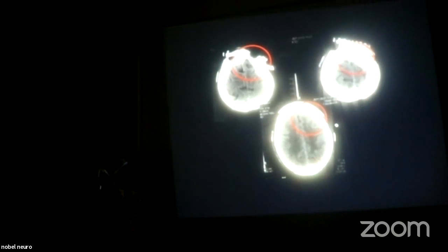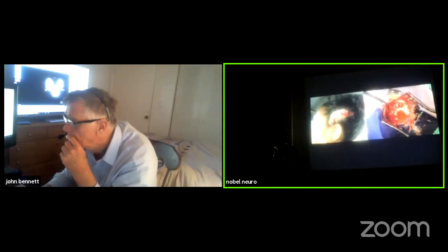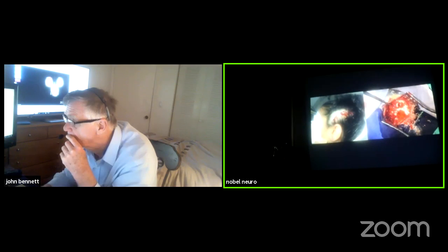As you can see, pre-op, post-op. You will see the size of EDH increasing with time. So you can see a very small skin flap. Large EDH again. And we stopped shaving the head of the patient, particularly if patients are female, we would also look for cosmesis.